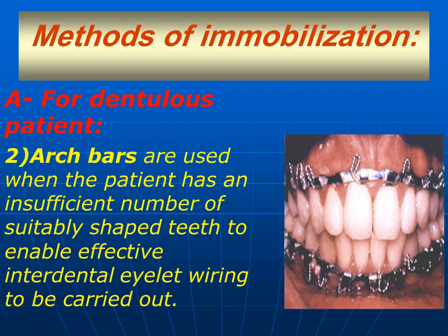And this type is used when I have, as I said, an insufficient number of suitably shaped teeth to enable effective interdental eyelet wiring to be carried out.